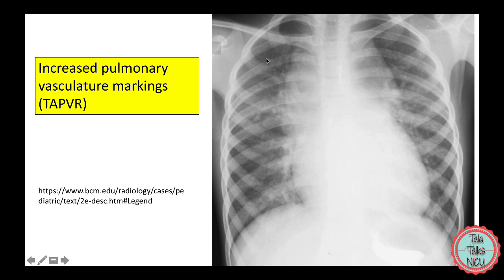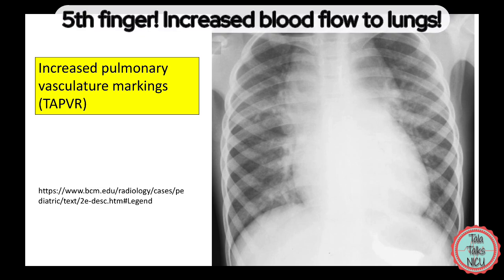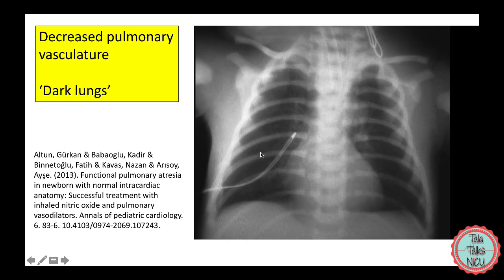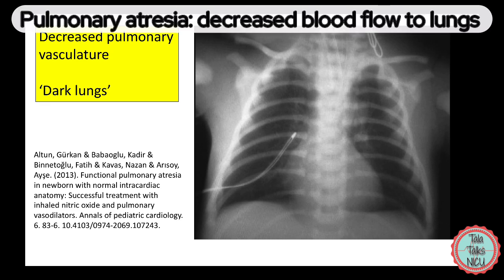In this x-ray, you can see the lungs look really wet or really white, full of vascular markings. That's because this is a TAPVR — total anomalous pulmonary venous connection — associated with increased pulmonary blood flow. This other chest x-ray looks much darker, almost black in appearance, with hardly any vascular markings at all. That's because this is an x-ray of an infant with pulmonary atresia, where very little blood was getting to the lungs, making the lungs much darker.